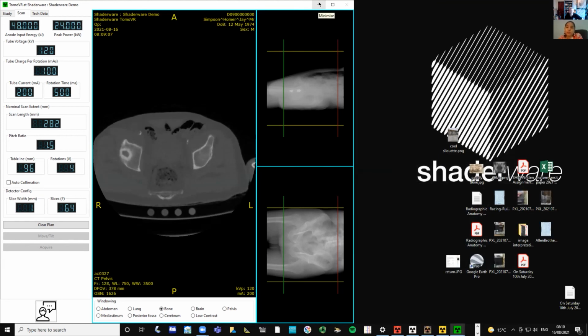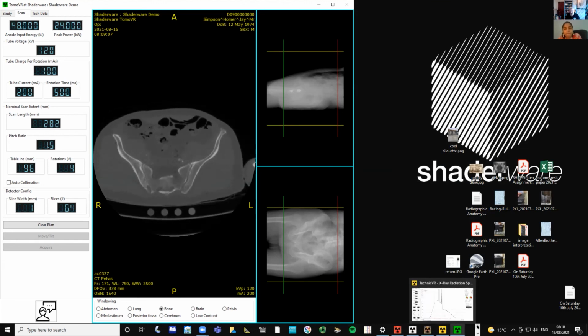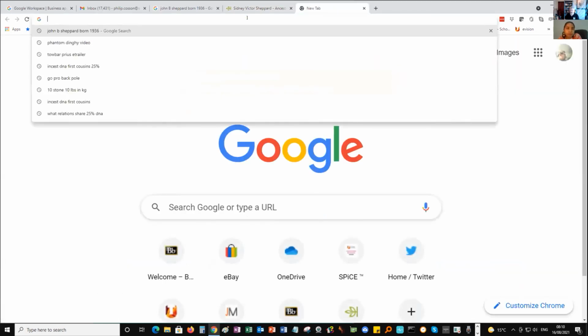Right. Will you be giving me the costing for this? Yeah, so I can send you the costings. Obviously, you will need to figure out how many of each thing you need, how many students you want and things like that. I'll send you a ballpark costings thing, and then you can say, well, how many licenses do you think we can purchase at this time?